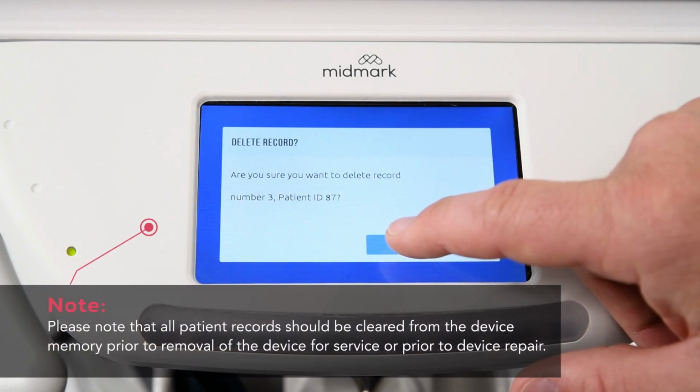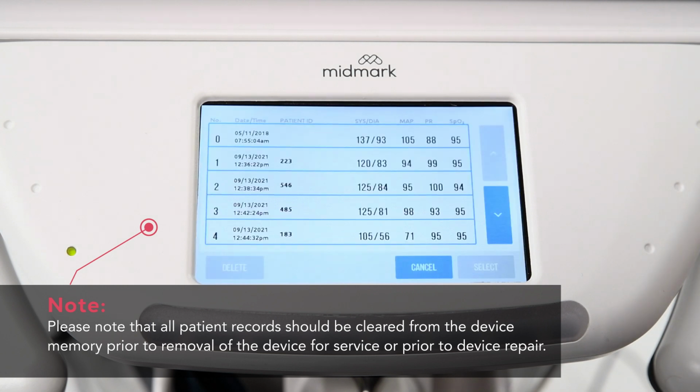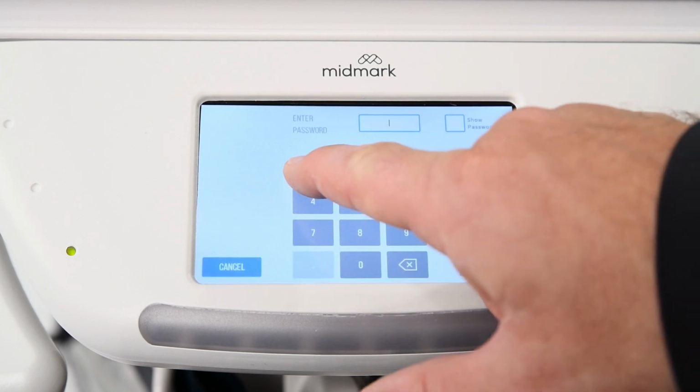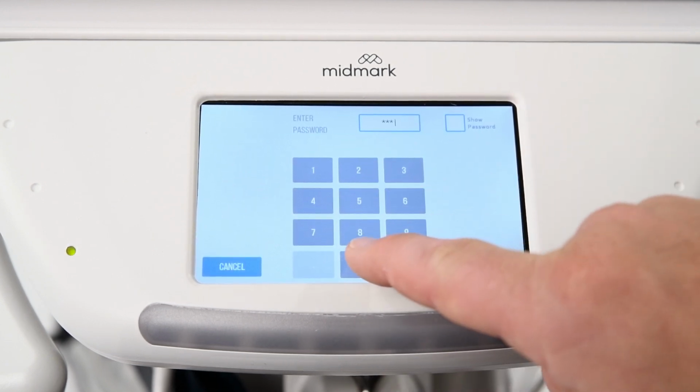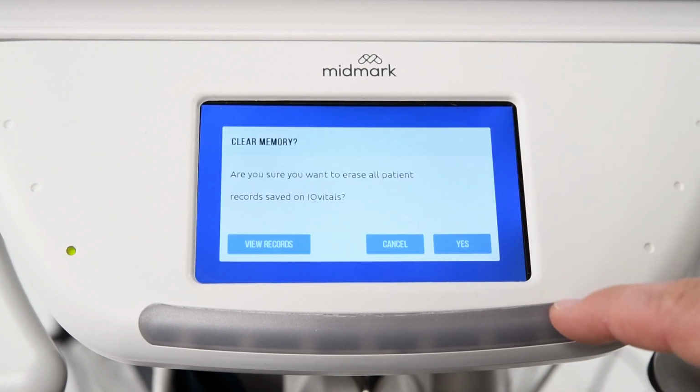Please note that all patient records should be cleared from the device memory prior to removal of the device for service or prior to device repair. The user may select and delete records one at a time, or may use the Clear Memory option in the More Settings screen to delete all records.